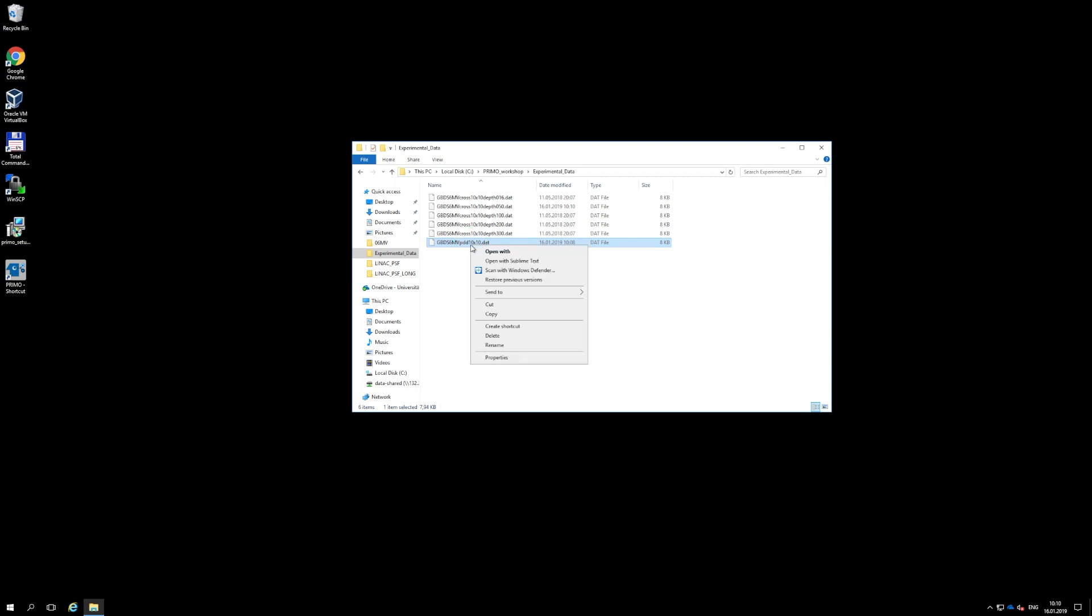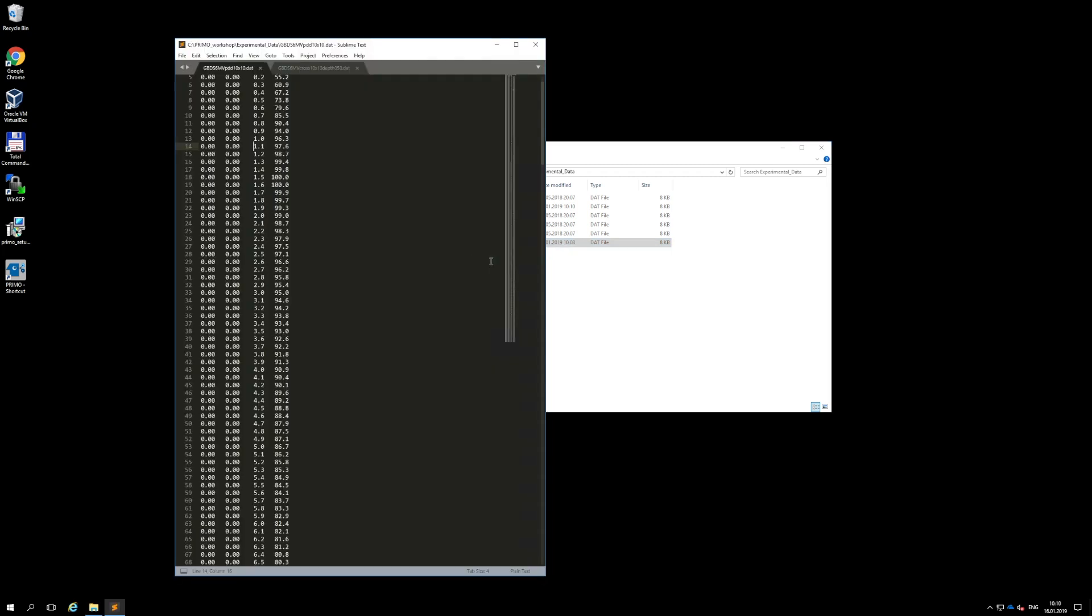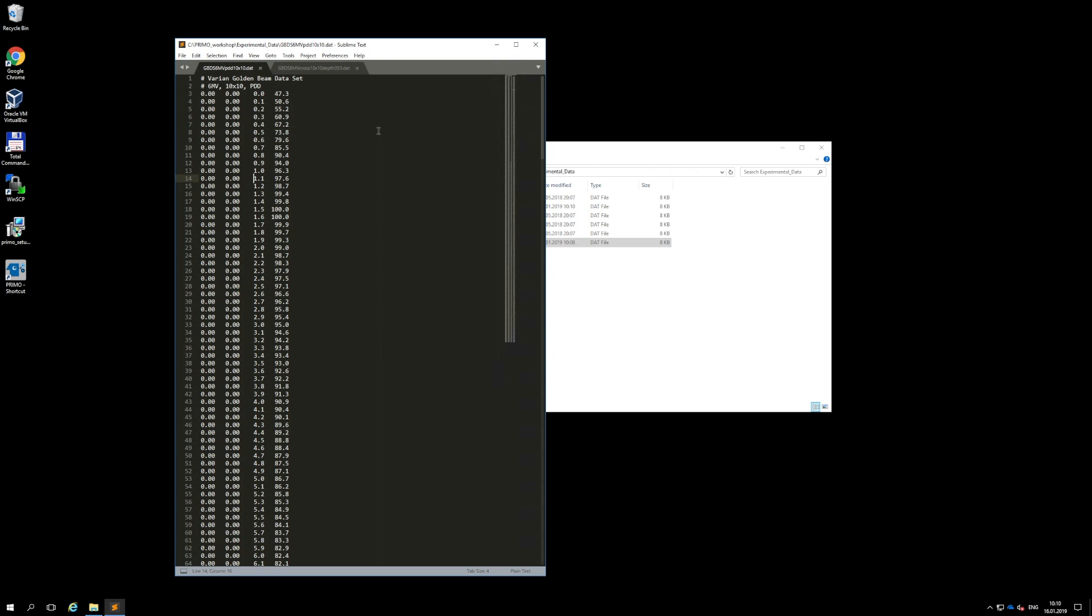To edit the files with experimental data, it is necessary to use a text editor. Word processors are not suitable since they insert invisible characters that will produce errors when read by Primo. Comment lines can be inserted by preceding them with a hash sign.